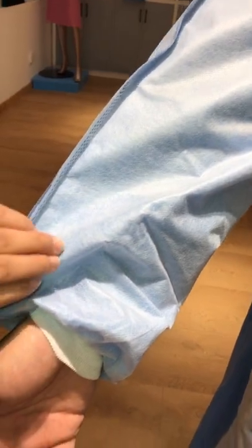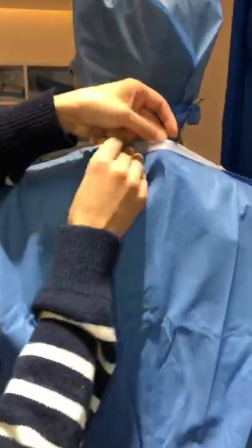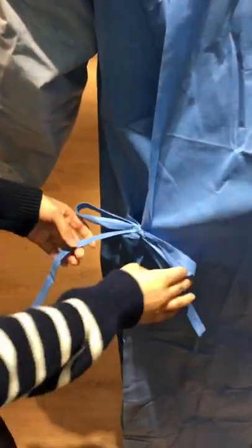This layer is PP and PE, which makes sure that liquid cannot pass through. Turn around — on the neck there is a velcro for adjustment, and it ties at the waist with four ties.